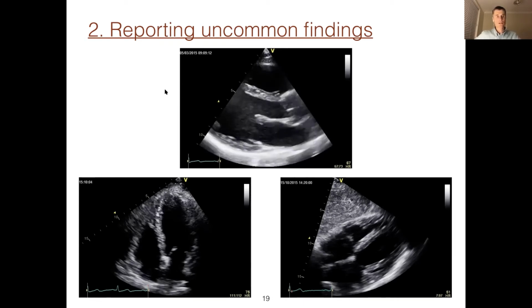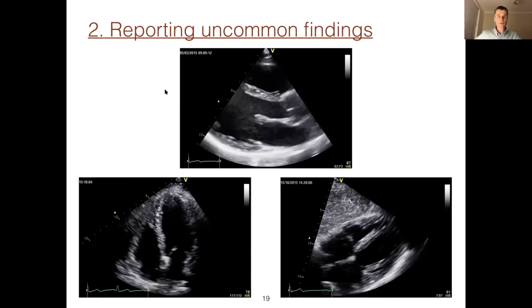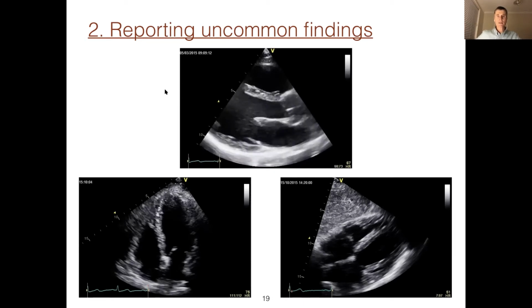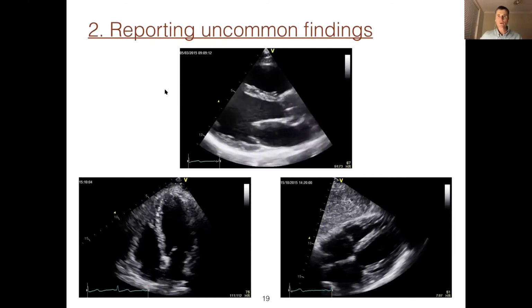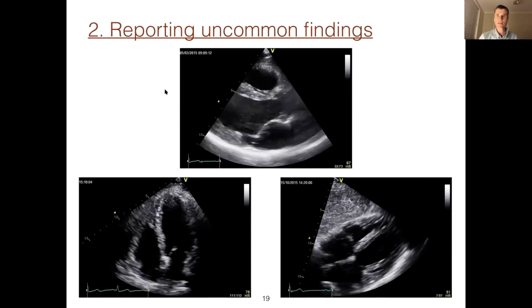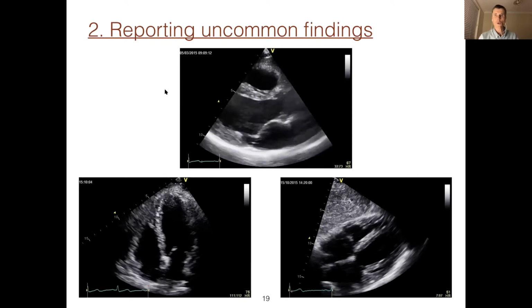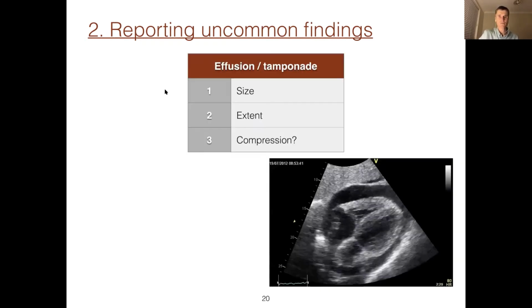And obviously you see the pericardium wrapping around all the chambers of the heart, but you shouldn't see any pericardial fluid. And so as soon as you do, you should start asking in your mind a couple of questions. Is this pathological? And almost always with a pericardial effusion, it is.